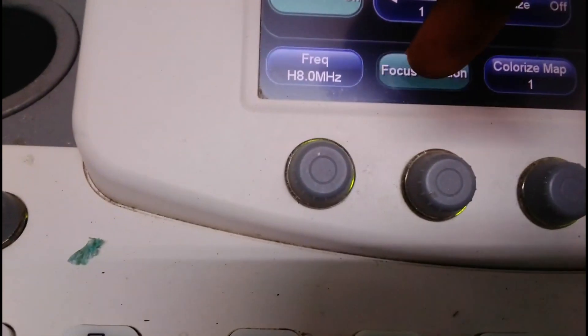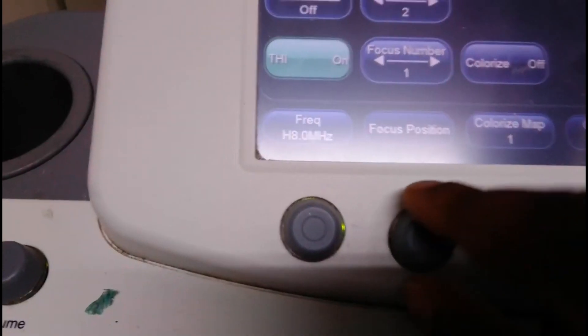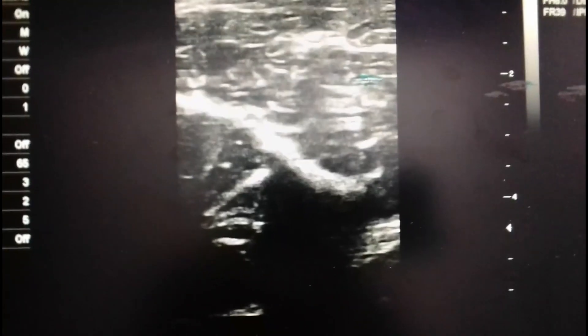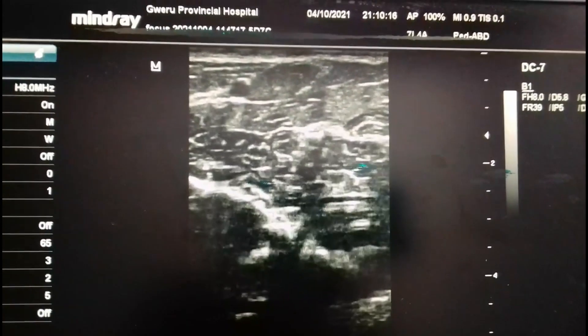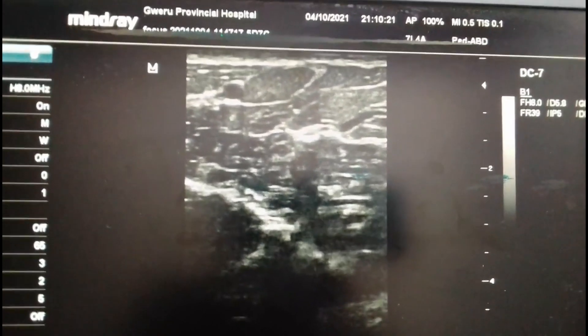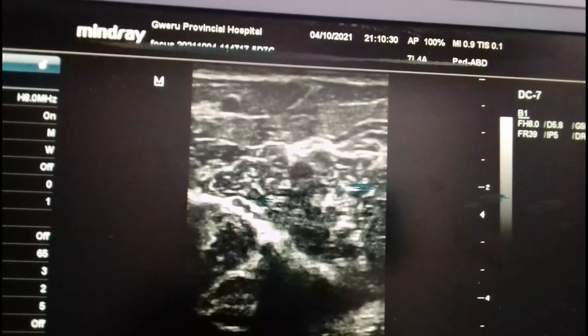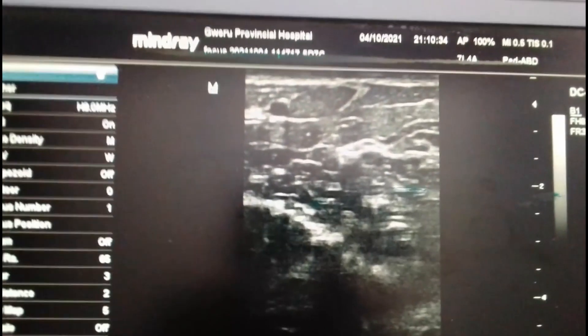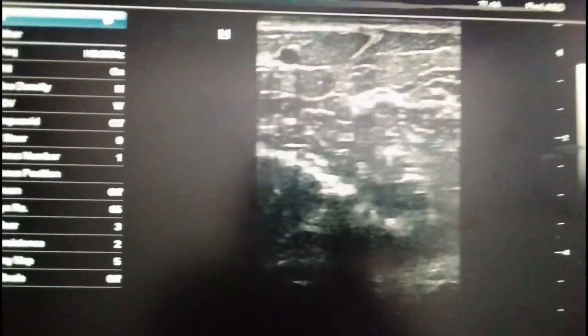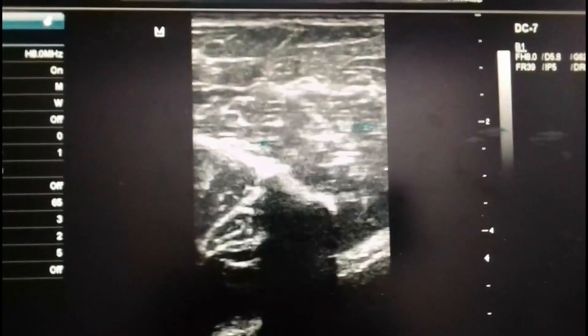At the top you can see it is at a little focus. To adjust the focus, we turn this knob — you can move it clockwise or anti-clockwise. You can see the arrow is moving on screen. This is a minor change because we are dealing with a superficial structure, so all the structures are almost within the same focal depth. If you are using deeper structures like abdominal scanning, the change will be more significant.